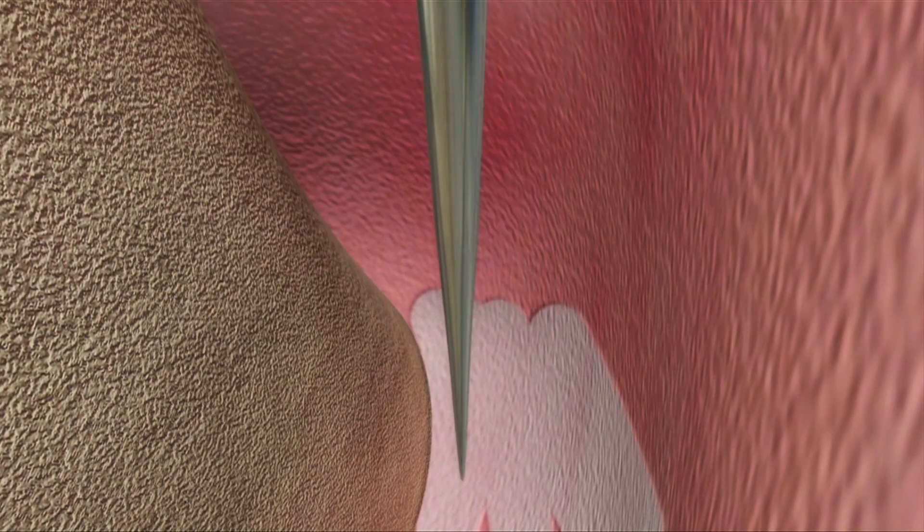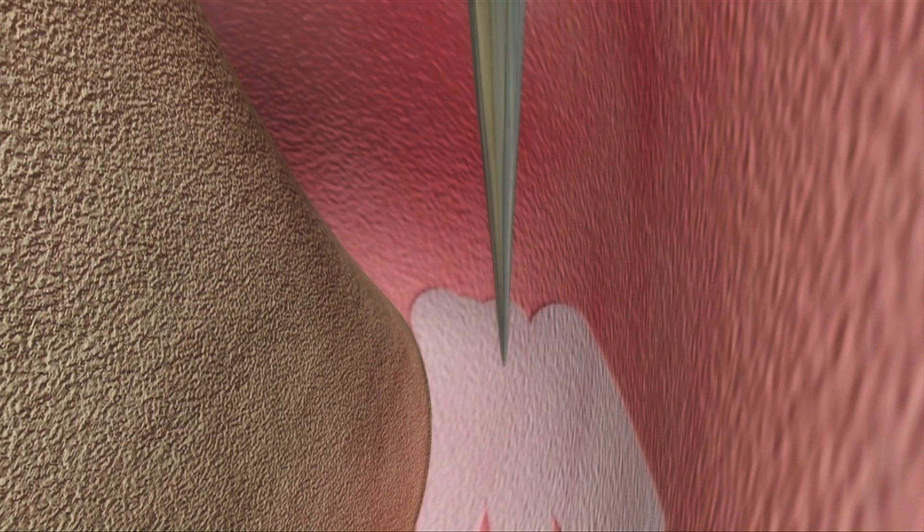An endodontic explorer is used to confirm that all soft tissue has been removed from the bone, so we get great regenerative factors coming from the bone.